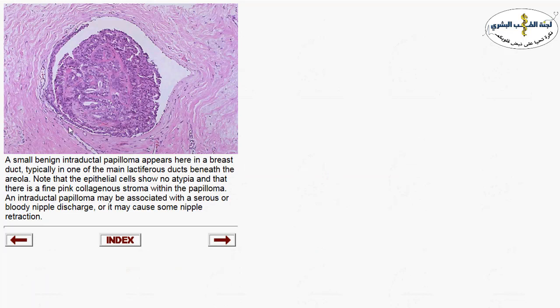Another lesion is the intraductal papilloma. It is a small mass-forming lesion lining the major lactiferous ducts at the nipple. It has collagenous stroma and epithelial proliferation. The presentation of intraductal papilloma is serous or bloody nipple discharge.